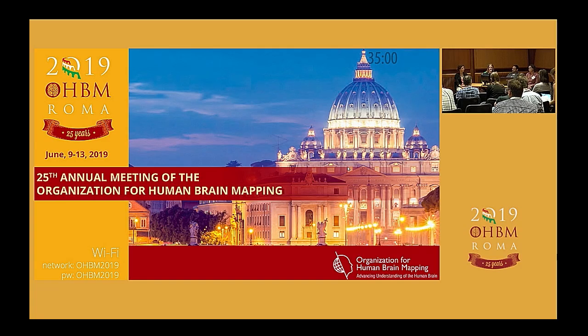So for the type of stuff I was talking about, of course, it's exactly the same, because it's really about ensuring that the scanner is operating properly, and that has to be the case no matter who it is or what it is that you're going to image. I suppose the issue that I primarily hear about imaging children is just that the level of motion is so much higher, and obviously then if they're smaller, there's issues maybe about sensitivity in terms of being able to have high sensitivity everywhere for them.